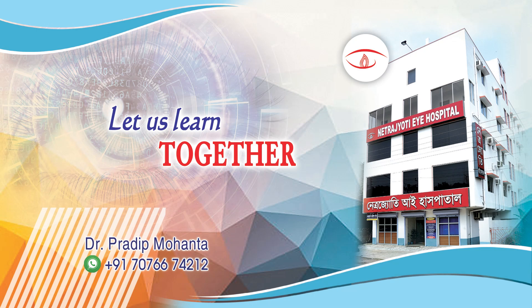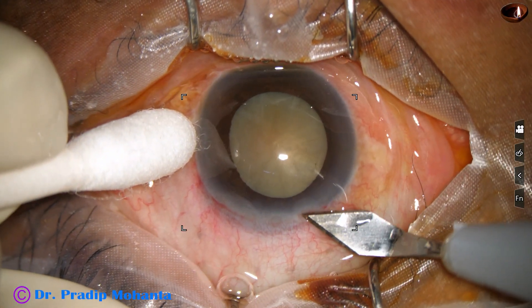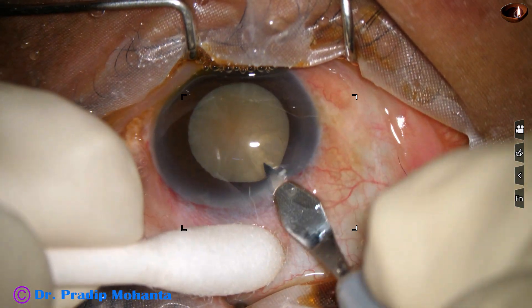Friends, welcome to my workplace at Ranakh Heart, West Bengal, India. This is a heart cataract with leathery fibers. Let us observe this surgery.